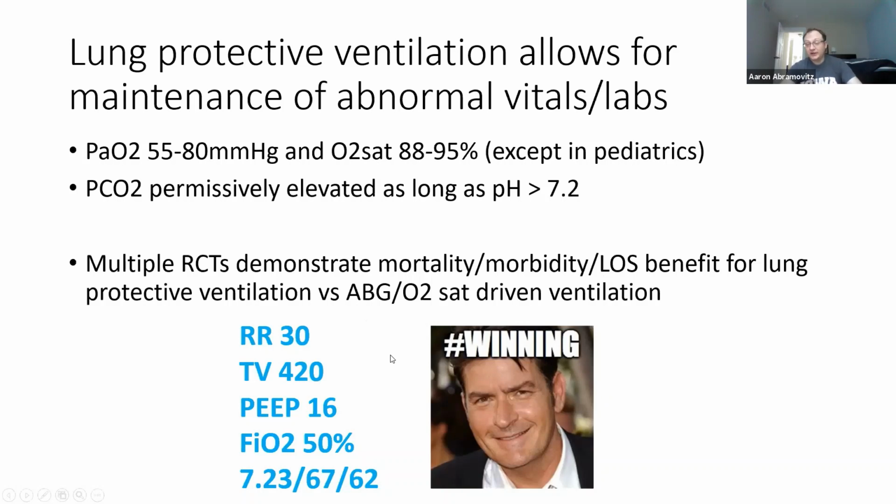As patients get better, you scale back on these, and the patients will actually on their own be able to maintain an oxygenation and a ventilation that you no longer need to tolerate this once the ARDS kind of resolves on its own. So as you wean ventilator settings here, you'll also see a normalization in blood gas as patients get better. This is during the acute phase where we're really focused on low tidal volume ventilation as the number one goal.